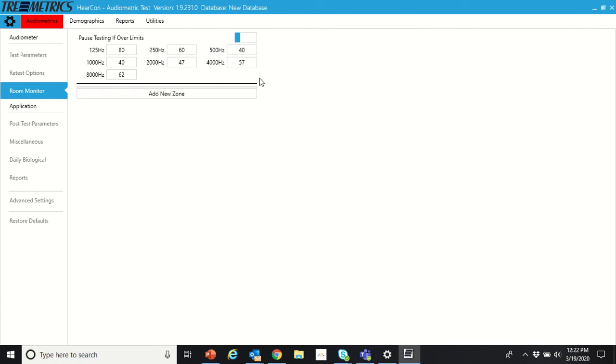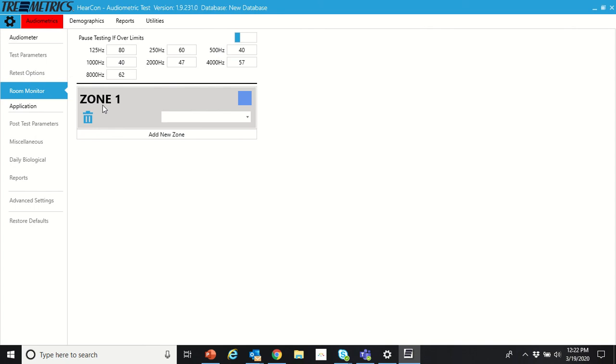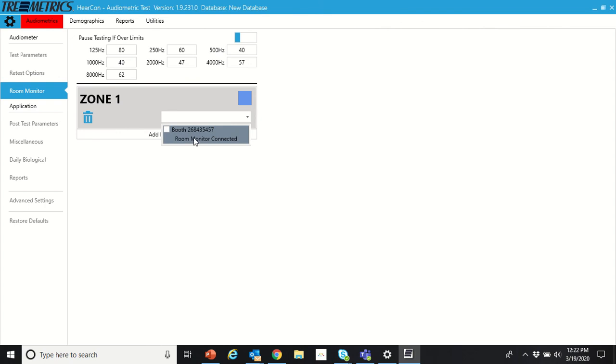To actually turn on the feature, we go to add zone. Zone one, we have a dropdown here. We have our booth and then room monitor connected. It's showing room monitor connected because it's picking up the microphone from the audiometer. We can click in there. Now we have zone one turned on.